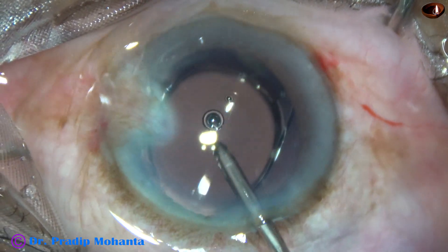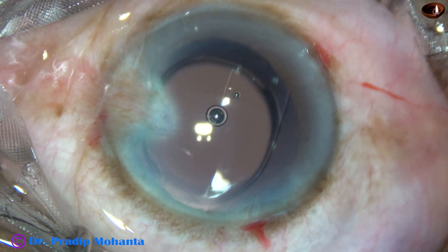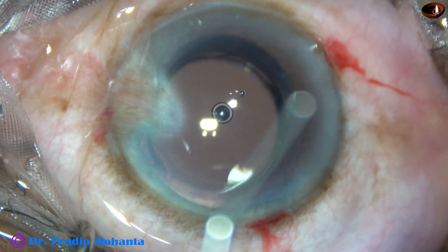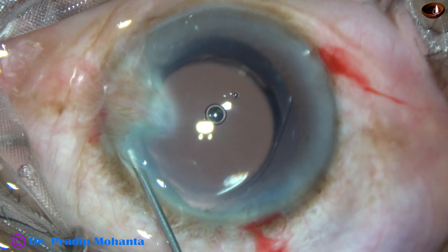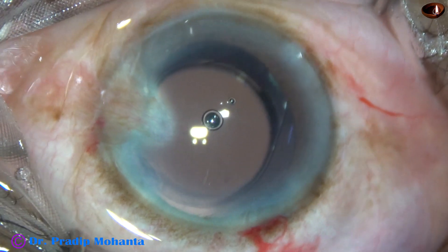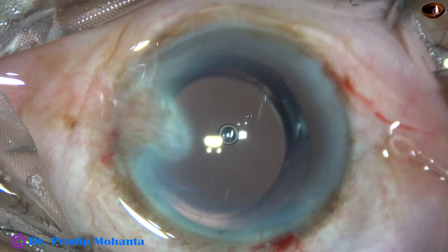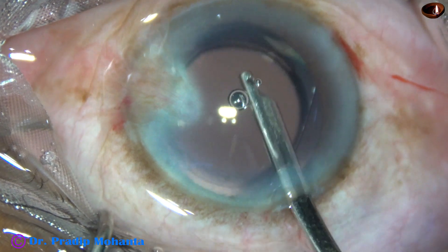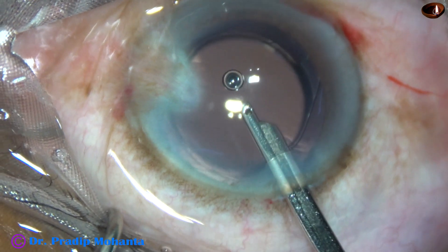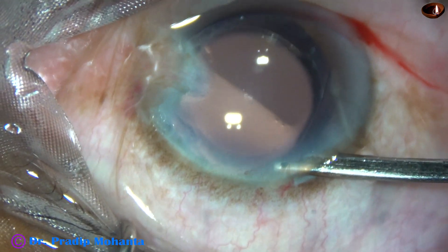It is a monofocal intraocular lens, and it has almost opened up. This is a bit of moxifloxacin, and now the side ports are closed by hydrating corneal stroma on either side of the stab wounds. You can see a small pterygium in this case. The patient didn't want the pterygium surgery at the same setting, and the patient's attendants wanted vision, not any cosmetic surgery. So only cataract surgery is being done at this setting, but the patient and attendants have been told to get the pterygium surgery done.